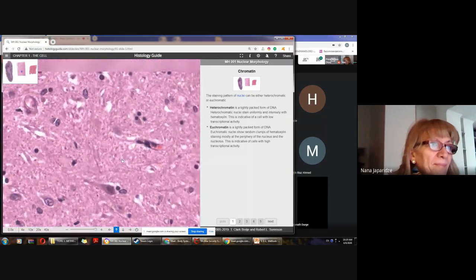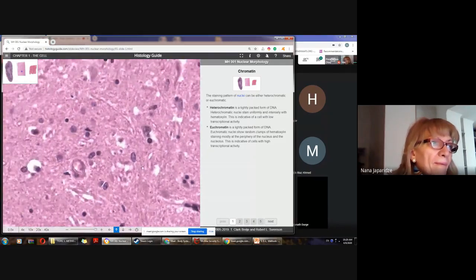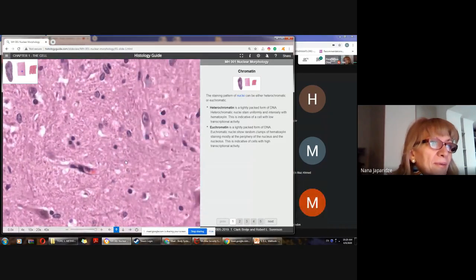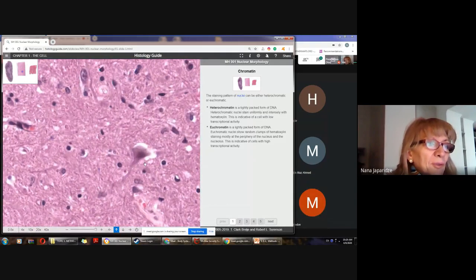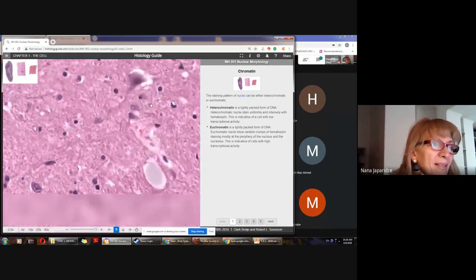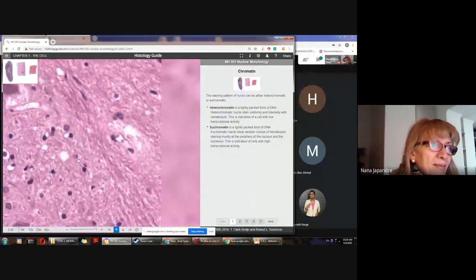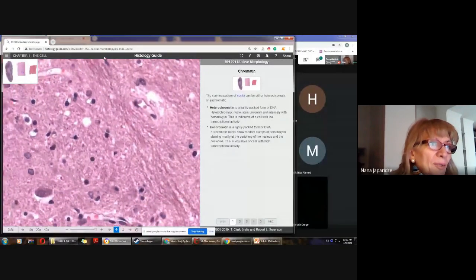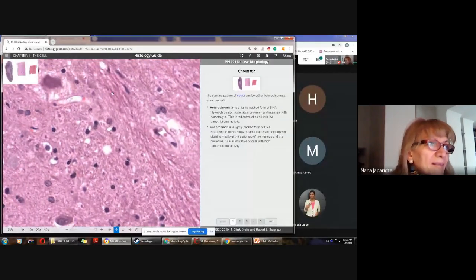Blood capillary again. So look, beautiful, huge, very big cell, neuron. So this is a bigger one, and here you can see, look, thread-like structures.